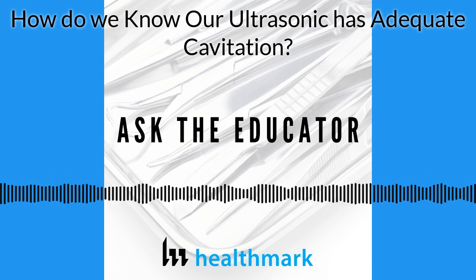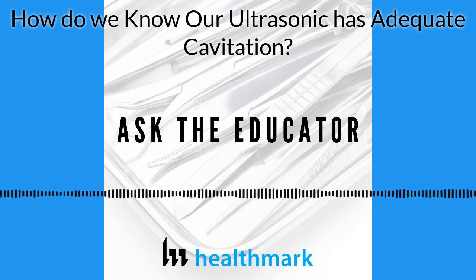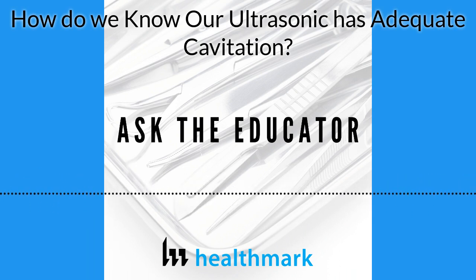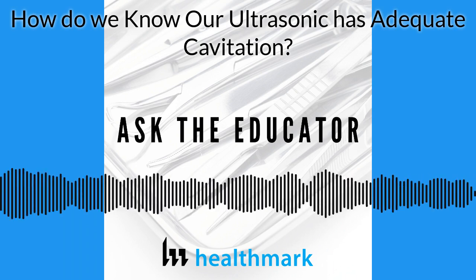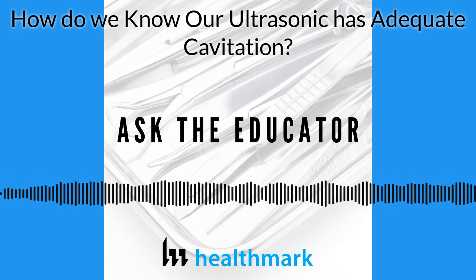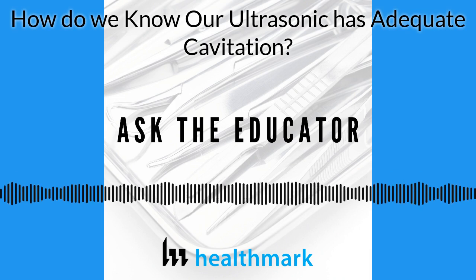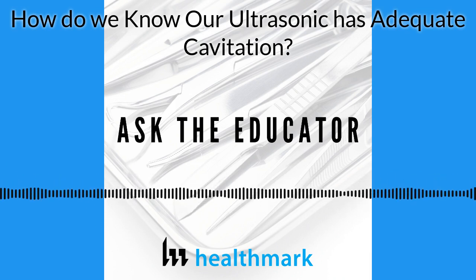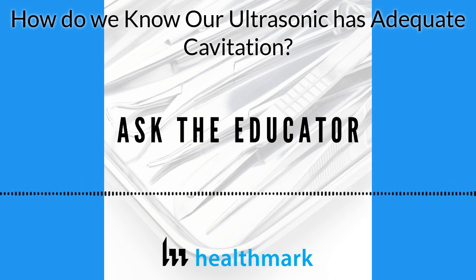We know we buy a sonic for its deep cleaning ability, and it's the cavitation that provides the deep cleaning. So we wonder, how do you meet these requirements? And so this gets to your first question. What is cavitation? Cavitation is really something very simple to understand. It's a cleaning process. It starts with these piezoelectric transducers, which vibrate. They have a diaphragm, and that turns them into a sound wave that goes through the liquid. And then the parts that are put in are cleaned.